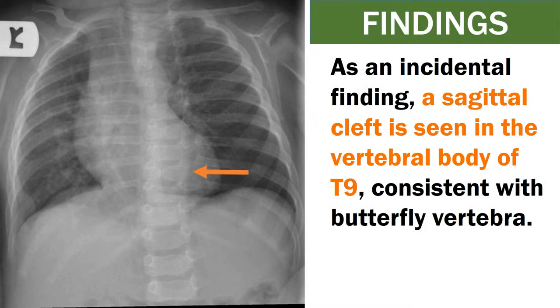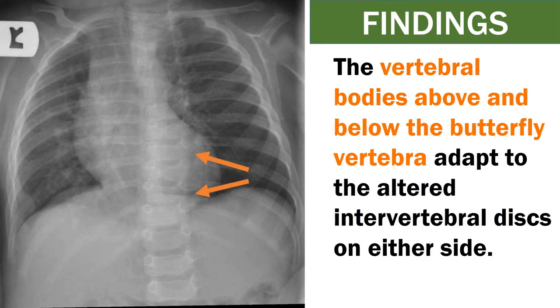As an incidental finding, a sagittal cleft is seen in the vertebral body of T9, consistent with butterfly vertebra. The vertebral bodies above and below the butterfly vertebra adapt to the altered intervertebral discs on either side.